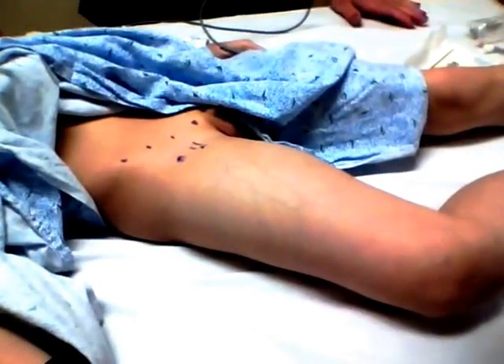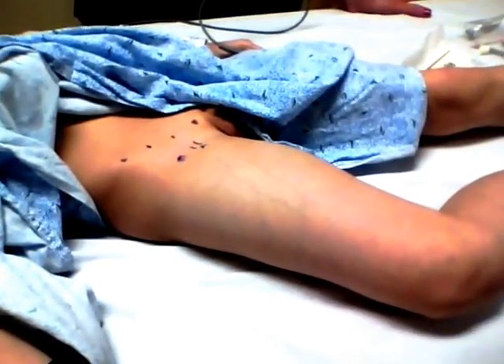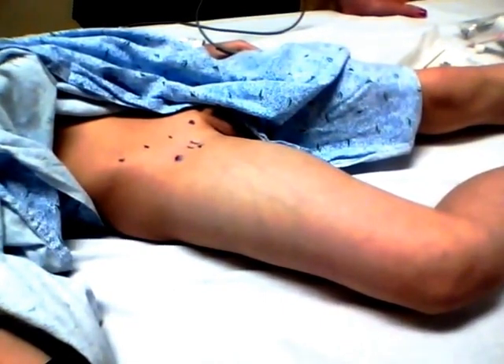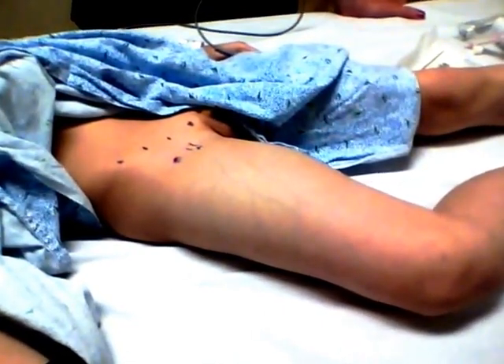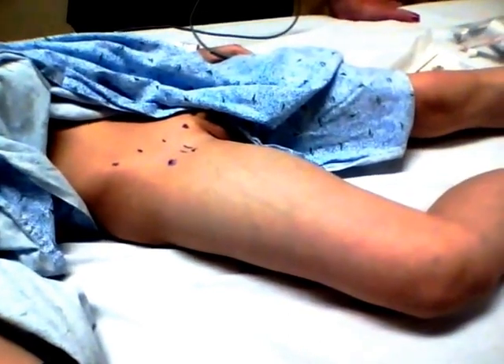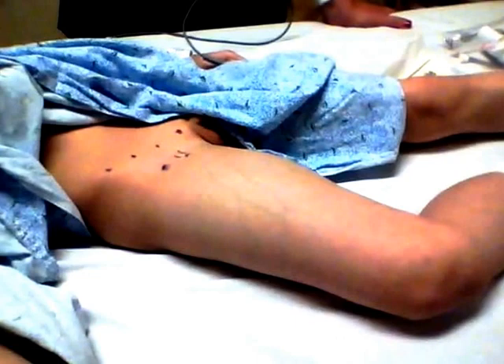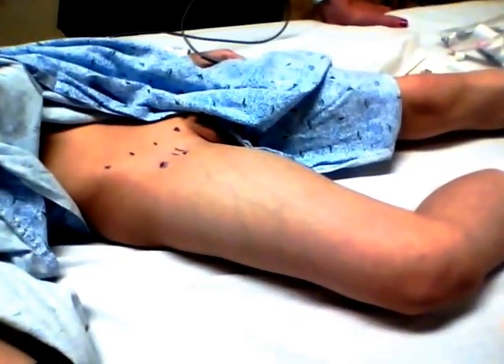We're going to talk about a fascia iliaca block in a child who has a femur fracture. This child was run into by a schoolmate and you can see just looking at his leg that he has an obvious femur fracture. We're going to put a block in that's going to numb that area up and give him some pain relief.